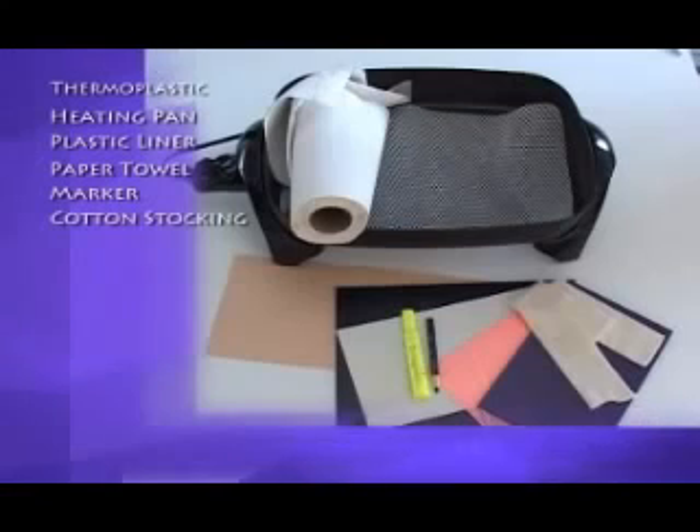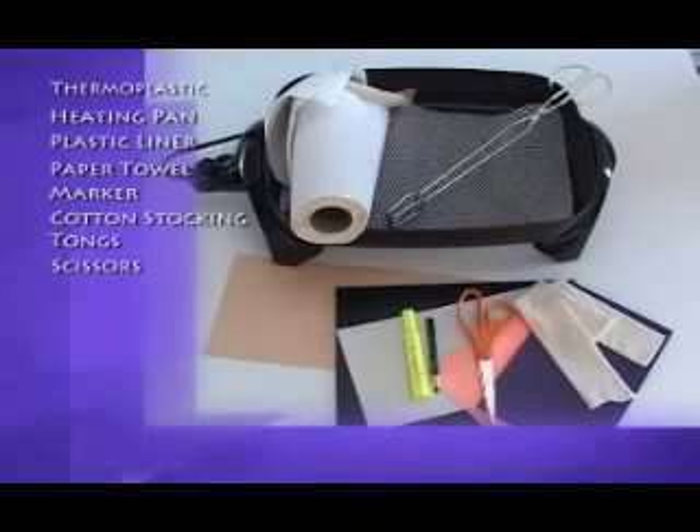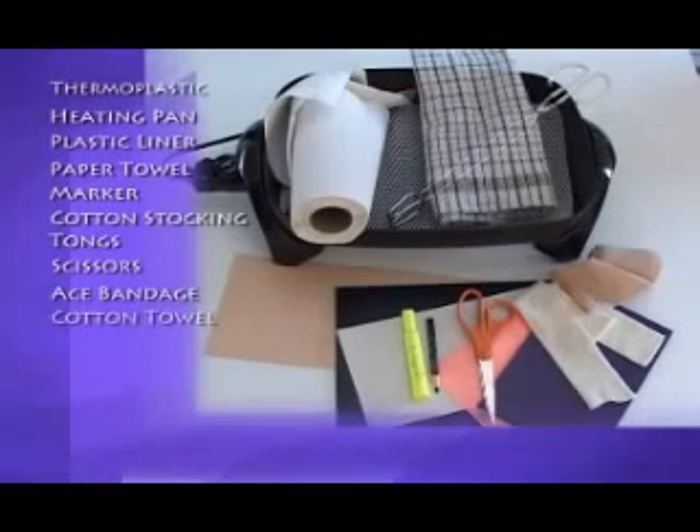A cotton stocking is used to protect the animal when molding the warm thermoplastic around the limb. Tongs are used to remove the heated material from the hot water. Scissors are used to cut the pattern from the paper towel and to cut the softened thermoplastic. An ACE bandage is useful for holding the thermoplastic in place on the animal's limb until it hardens. A cotton towel is used to dry the thermoplastic once it is removed from the hot water.